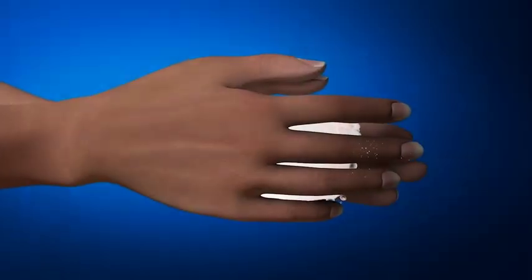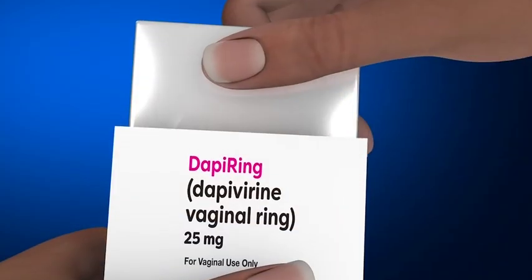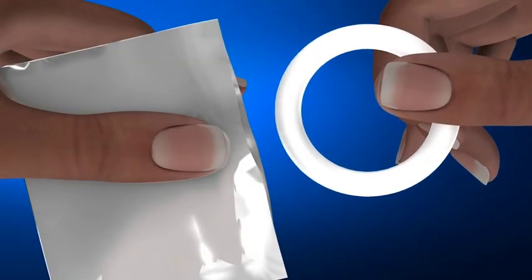Set it and forget it. Before inserting the ring into your vagina, wash your hands in clean water and dry them. Check the expiry date on the package label. Do not use if the ring is damaged or expired. Tear the package open, and in a clean place, remove the ring from its package.